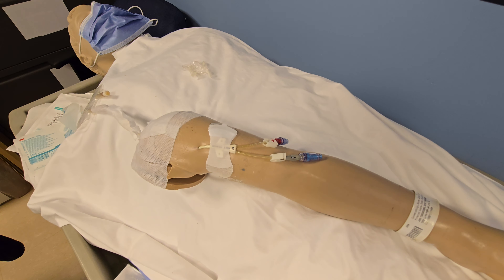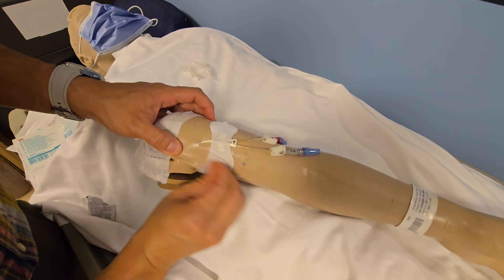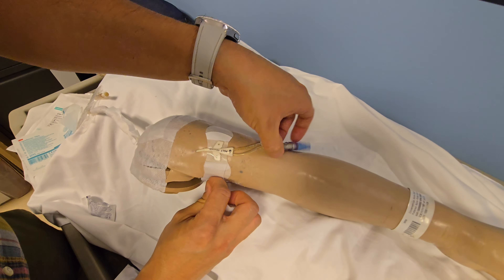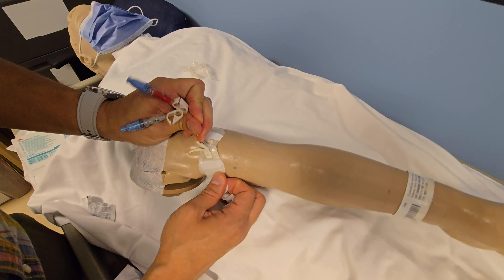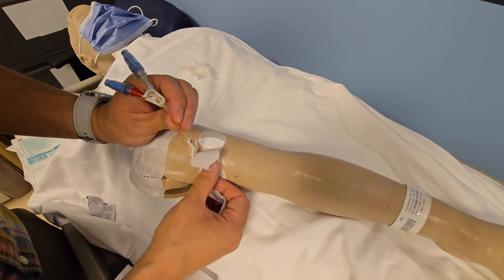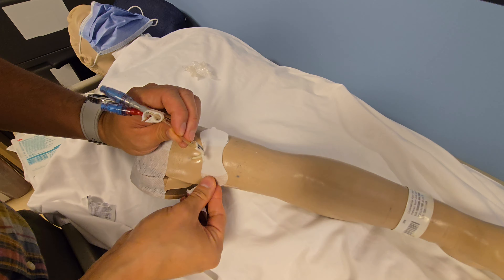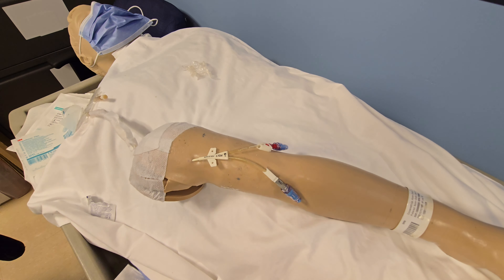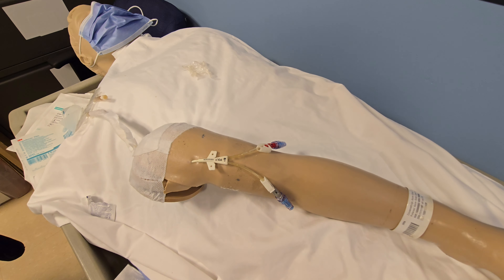To remove the Grip Lock, use an alcohol swab and moisten the sides. Peel this off, and this part here — just lift it up. This brand is a little stickier, which is actually quite good because it grabs onto the line. Once the line is out, close this part and then remove it. If it becomes too sticky, apply more alcohol until everything comes off. And that is how we change our central line dressings and securement devices with all three brands. Thank you.